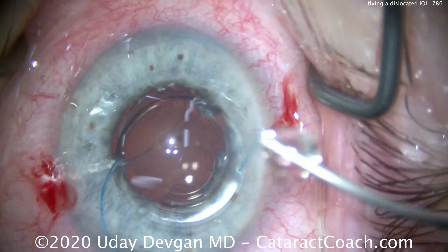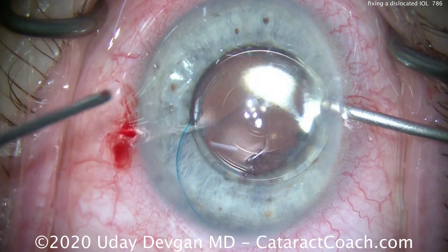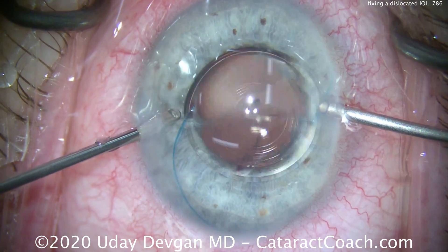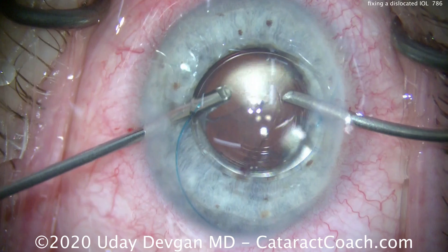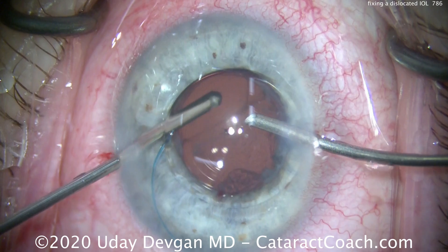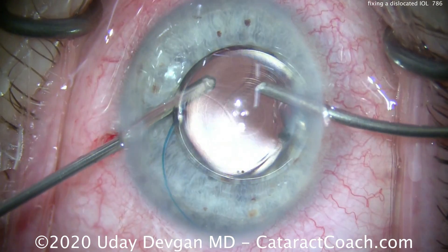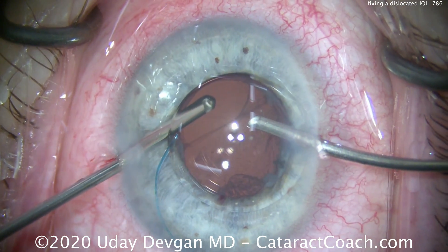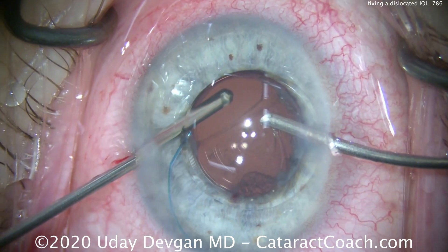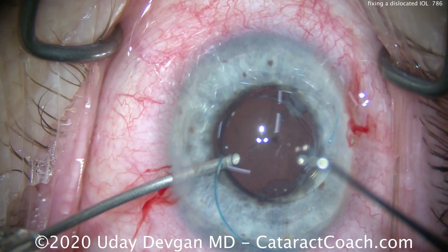Notice we only use two tiny paracentesis incisions — we don't need to open up the main phaco incision. Going back inside the eye to clean up the prolapsed vitreous, you can see it going right to the incision. Take your time with this — don't rush. Remember, you'll need to restain with triamcinolone to ensure complete removal of prolapsed vitreous. We don't want to take out capsular support at this point, so while it's tempting to clear the visual axis with the vitrectomy cutter, let's leave as much support as possible — we can always YAG it later.